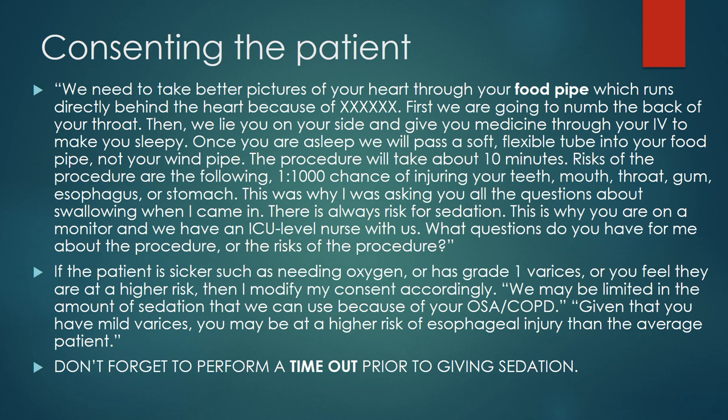So if the patient is sicker, such as they're needing oxygen or has grade 1 varices or has had prior esophageal surgery, we may say, your risks are a little bit higher than the average patient. And so I use this opportunity to highlight those slightly higher risks and make sure that they're on the consent form as well.